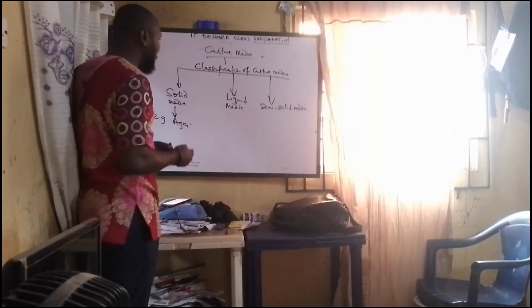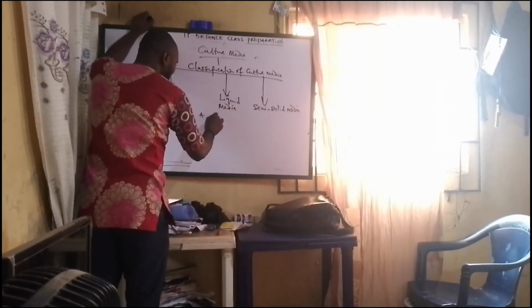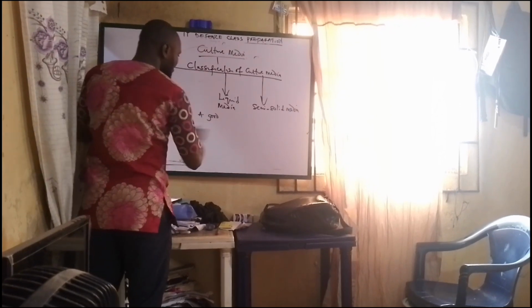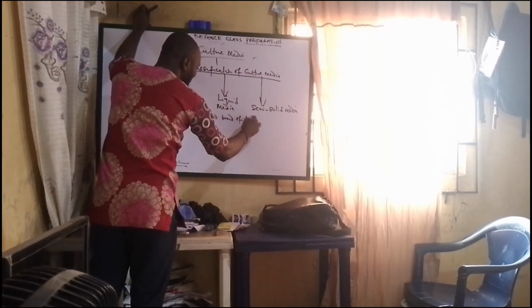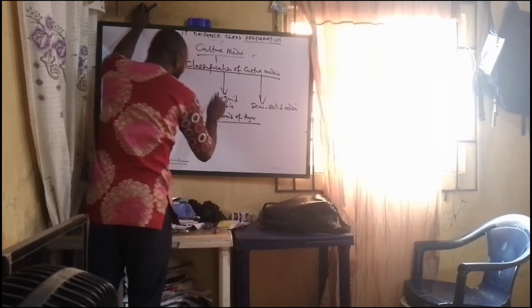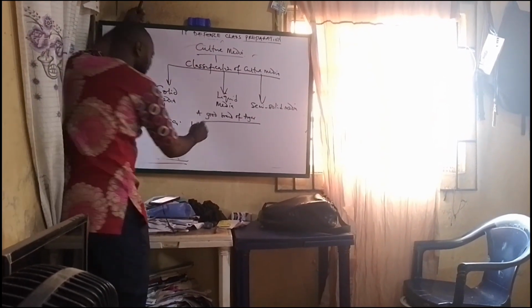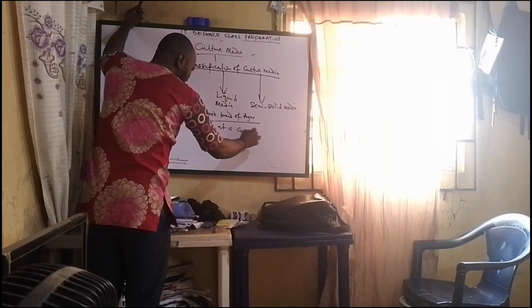Now, a good brand of agar must have the following conditions. One, it must be a gel at a concentration of 1%.